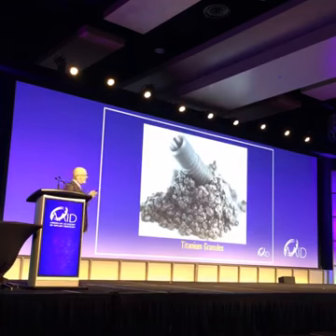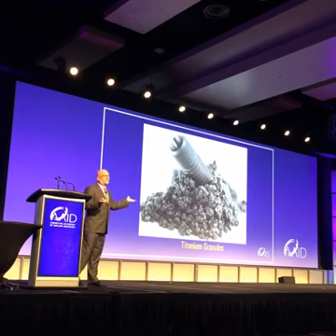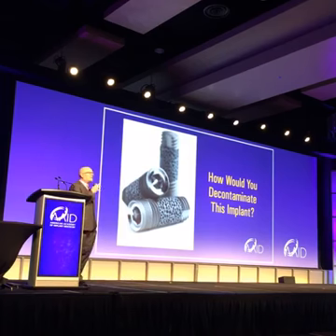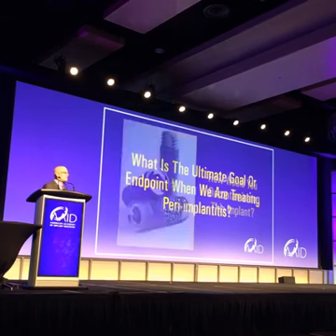Sometimes that's not available. Or you can use titanium granules. How would you decontaminate this implant? Some doctors say if you can't decontaminate the implant, you've got to take the implant out. Depends on who you talk to. Who do you believe? Who are your mentors? What do your mentors say?